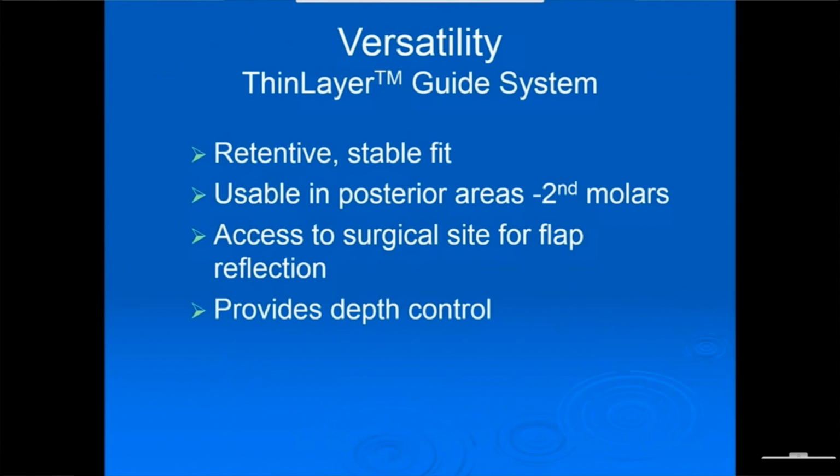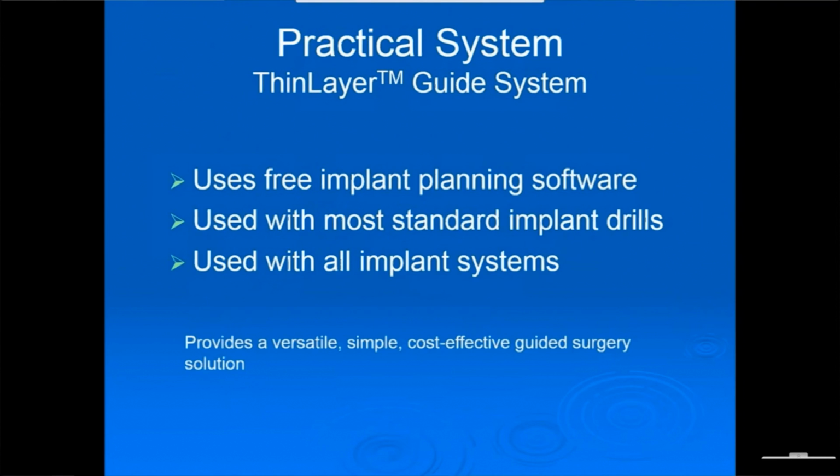Our system is versatile. The guides offer retention and a stable fit. They're usable in posterior areas, even second molars. You have access to the surgical site for flap reflection, if you wish, and they provide depth control.